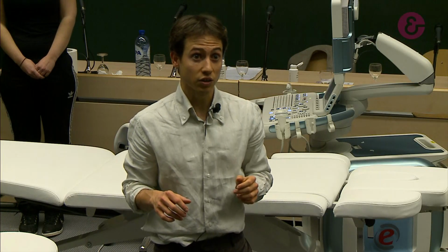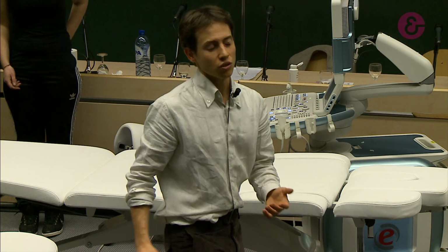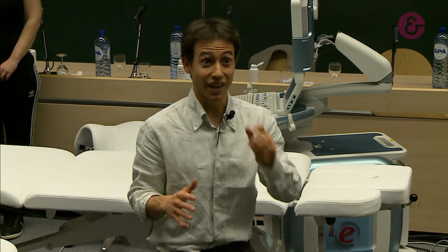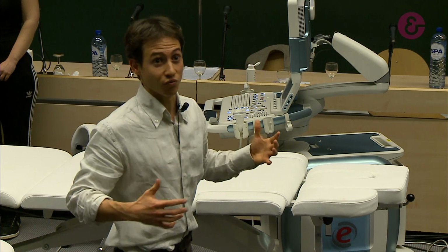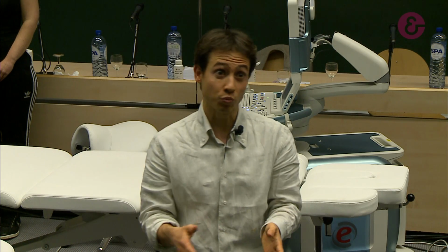And once the patient is able to do that, I will start using some perturbation. So start moving your leg. So normally, if I'm able to do a very good clinical examination, I can understand, for example, a rotation syndrome. For one side, I try to be very focused on a treatment in that direction as soon as possible.